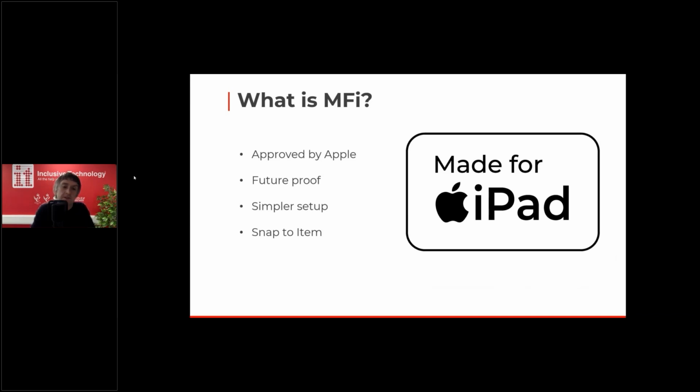Also, in addition to that, there is a simpler setup for this eye tracker when using it on an iPad. Previously, when using eye trackers on an iPad, you needed to adjust certain settings in the accessibility menu and AssistiveTouch in order for the eye tracker to work. This isn't the case for Eyetuitive. All those settings will be set automatically. The only thing you really need to set in there is the dwell time, which is completely up to you, whether you choose to use dwell on or off and set the time.